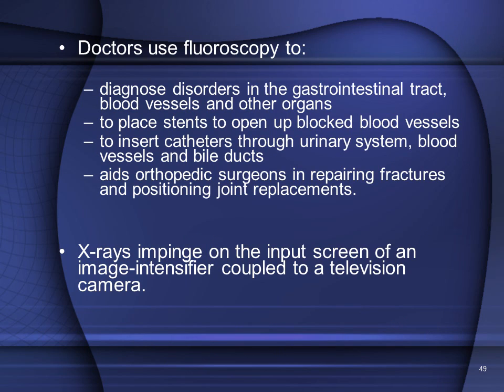Fluoroscopy can be used to diagnose disorders of the gastrointestinal tract, blood vessels, and some other organs. It can also be used to place stents to open up blocked blood vessels, such as in coronary angiography. And you can insert catheters in through the urinary system, blood vessels, and bile ducts. It also aids orthopedic surgeons in the repairing of fractures and the positioning of joint replacements.